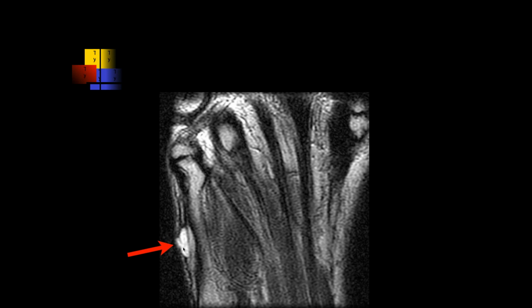Okay, so this was a little injury. Do you know what structure that might be over there? No, I assume it's probably one of the intrinsic muscles.